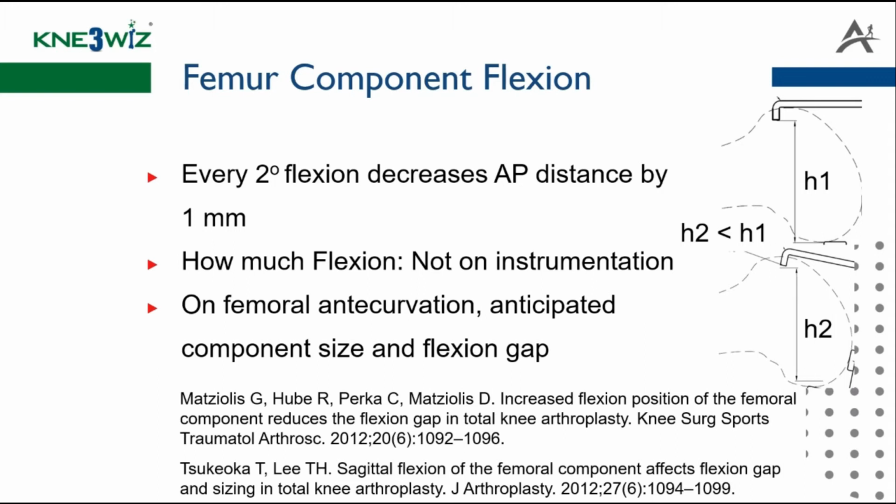Most per-operative technological aids, including robotics, do not give any information to the surgeon about the femoral bow as well as the mediolateral overhangs in all 4 zones. Thus, even ultra-precise cutting tools might not be able to give us the desired result.